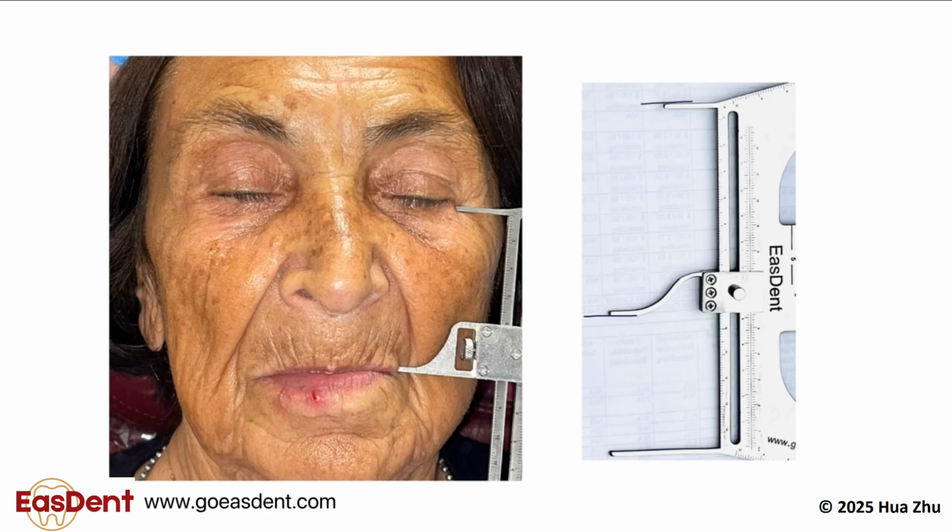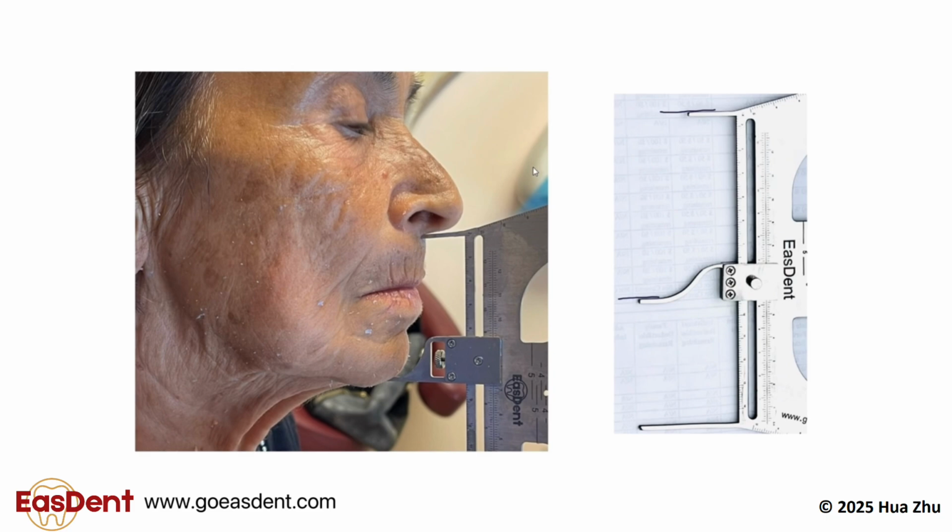When you use the moldable material in the Easdent tray later to record the VDO, you will guide the patient to bite down slowly at the centric relation until the outer edge of the shorter stick touches the lower border of the septum of the nose and the inner edge of the movable stick touches the outer border of the chin.